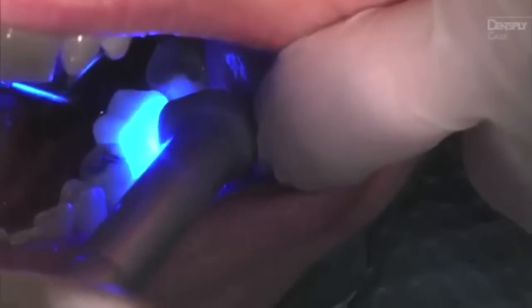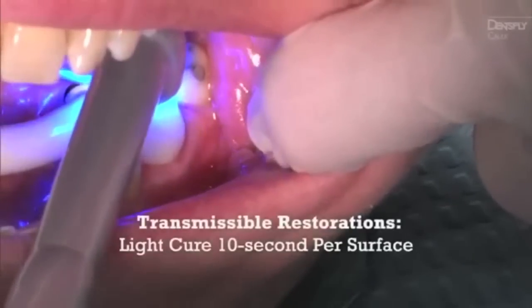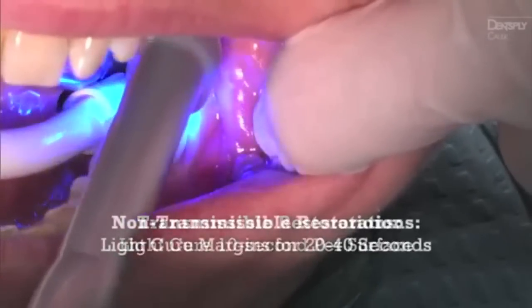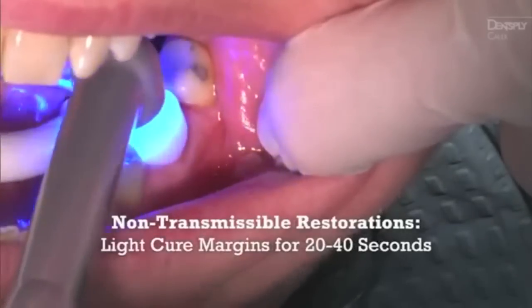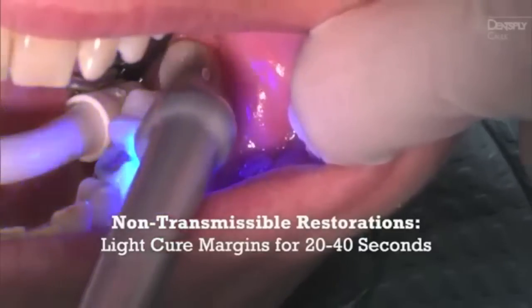light cure all areas — buccal, lingual, and occlusal surfaces — for 10 seconds on transmissible restorations. For non-transmissible restorations, light cure exposed margins for 20 to 40 seconds to assist restoration stabilization.